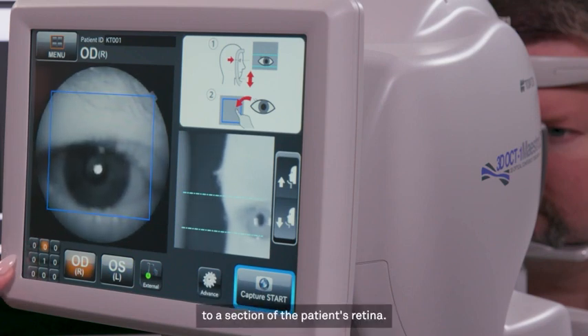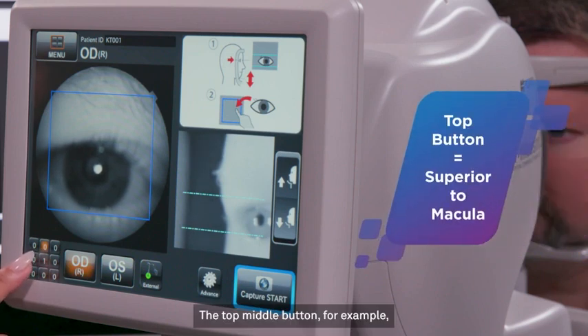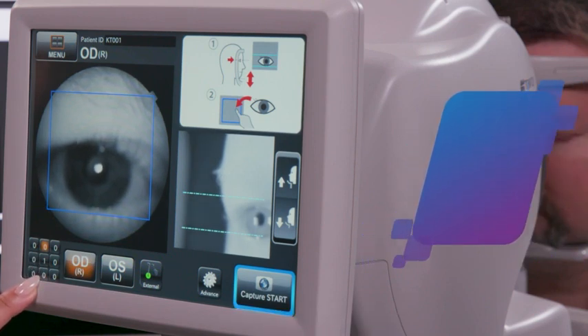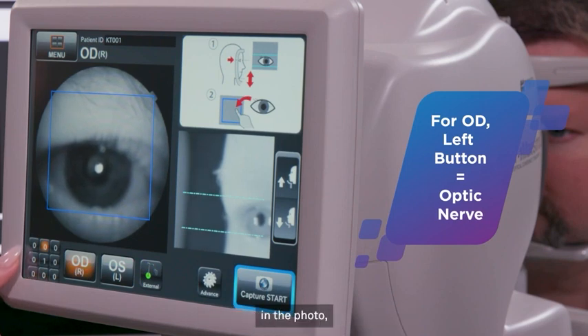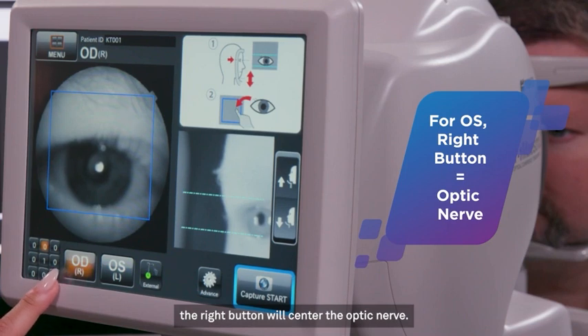Each button corresponds to a section of the patient's retina. The top middle button, for example, will photograph the section superior to the macula, while the bottom middle will photograph inferior to the macula. When photographing the right eye, the left button will center the optic nerve in the photo. And when photographing the left eye, the right button will center the optic nerve.